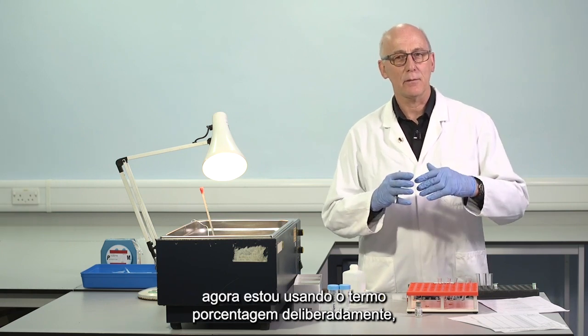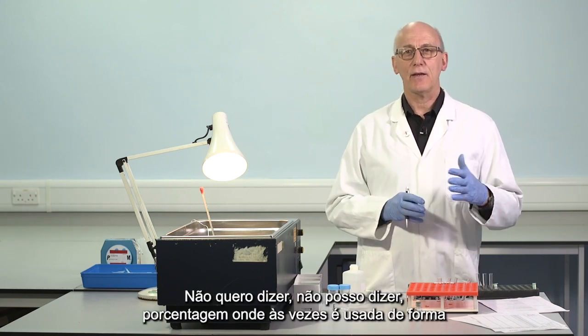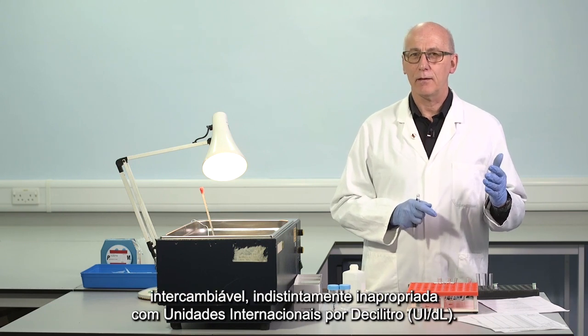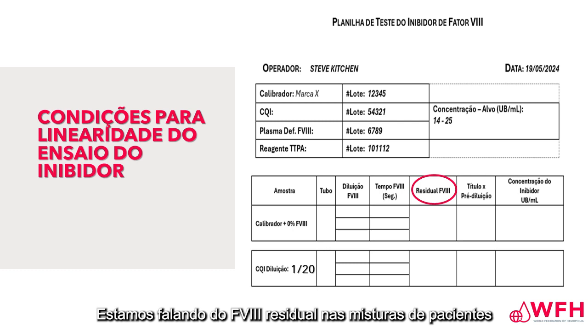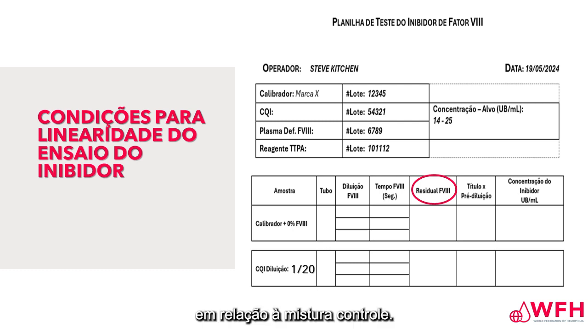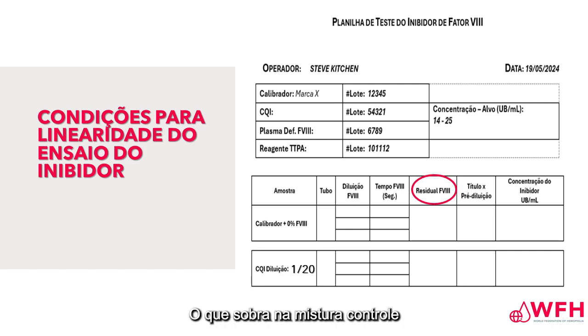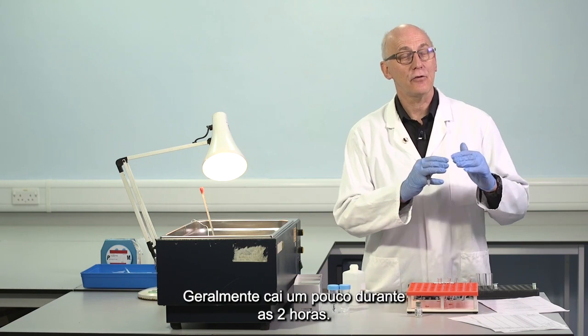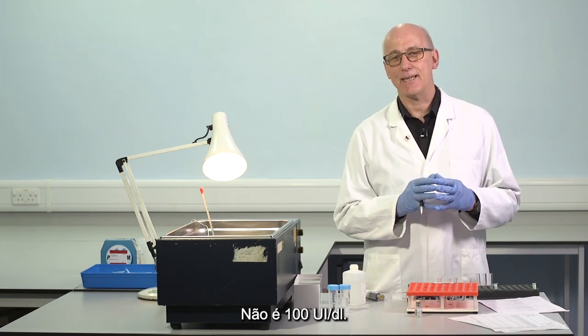And I'm now using the term percent advisedly. I do not mean percentage where it's used sometimes interchangeably, inappropriately with international units per deciliter. We're talking about the residual factor VIII in the patient mixtures relative to the control mixture, where we take the control mixture as our 100% point of reference. Whatever remains in the control mixture, we consider 100% residual. It's not exactly the same place it started. It usually drops a little during the 2 hours.